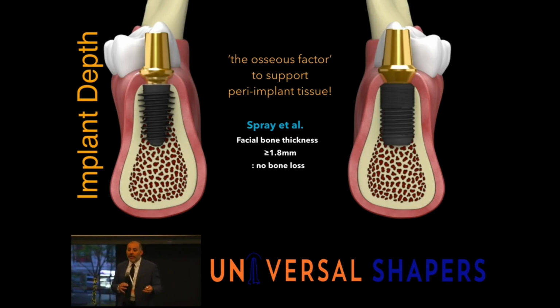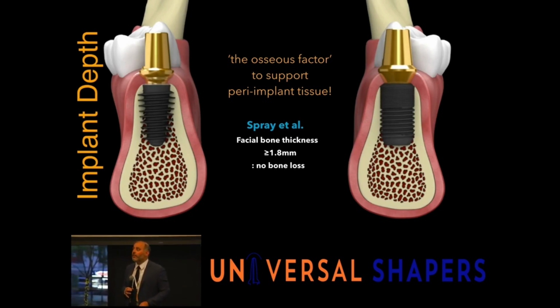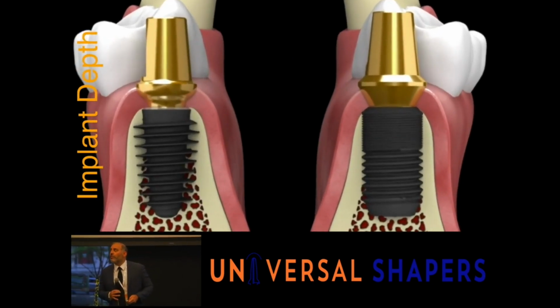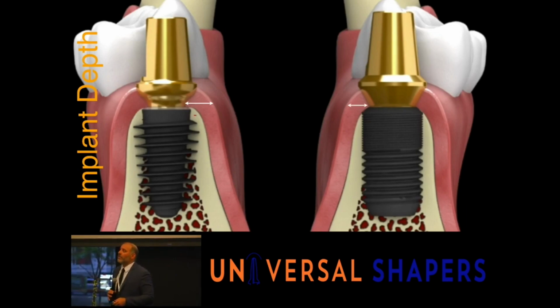And for the implant we're using today, we're going to use one from Megagen, the AnyRidge. This is one of the pioneers. I've been using this implant for over 10 years. It's one of the pioneers in that respect of this cut-back design where the threads start a little bit lower down. So we can see these little widths over here of bone. We can preserve more. We can have a little bit extra soft tissue and extra bone to accommodate, whereas the implant on the other side makes it a little bit harder or more challenging in those situations.